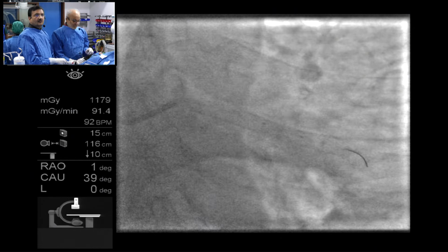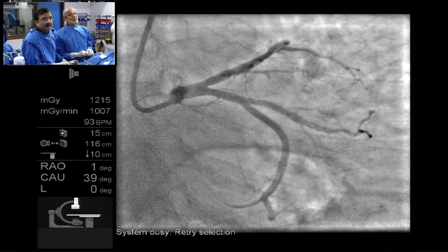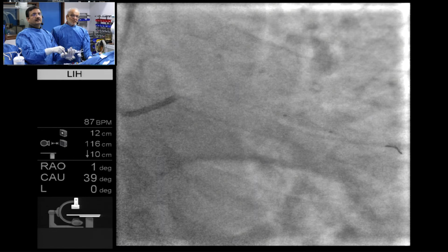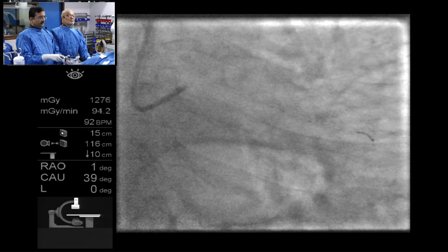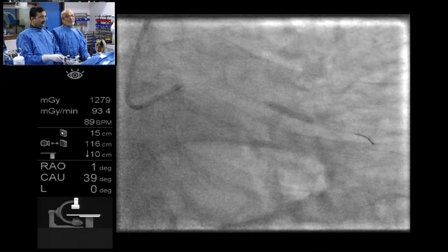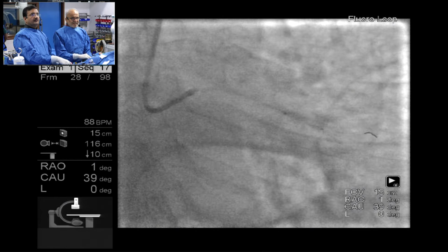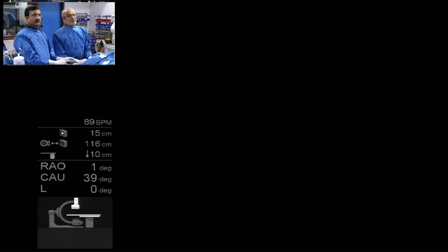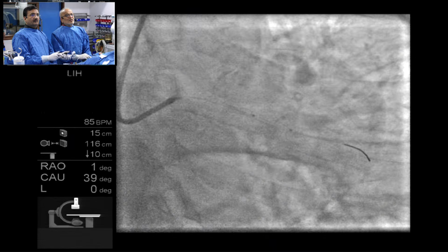Oh, that's nice. Just inject on cine and see. A little back. Back. Come back. Good. That's good. Go on 12 here. Deflate. Now I come back and we'll go on 16. Okay. Come back exactly, now almost there near the aneurysm segment. Inside a little bit. Here. 16.